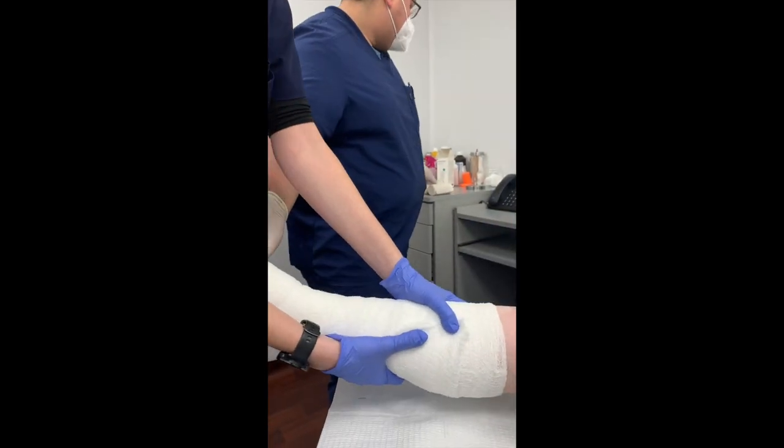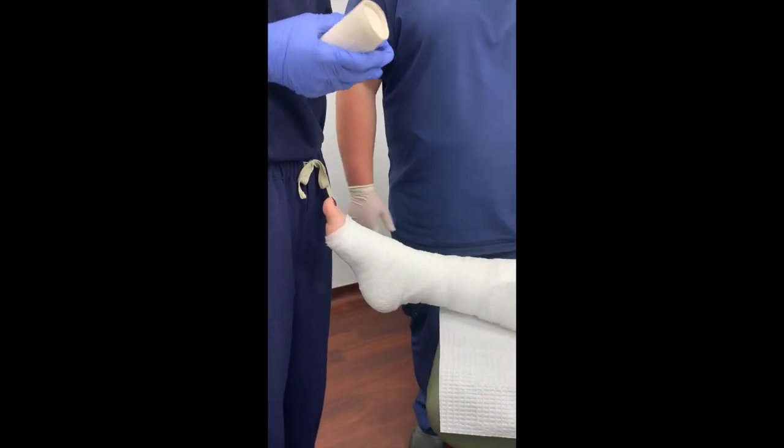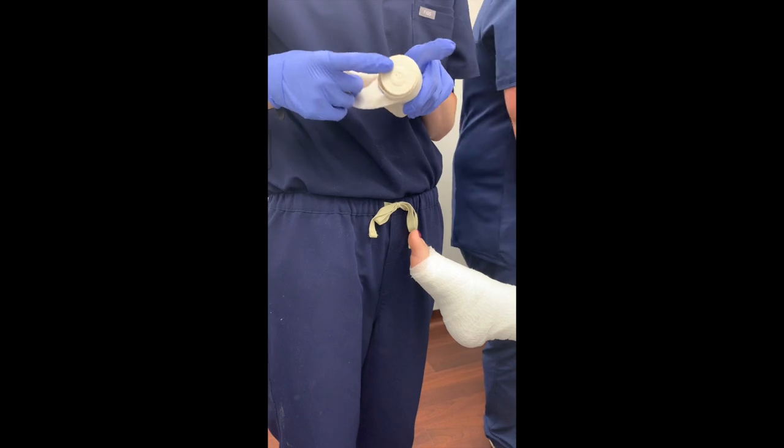Contraindications for this would be if your patient has an acute DVT — obviously you don't want to put on a bunch of compression and dislodge that DVT. So, here again we have the snail with the head of the snail here and the shell up on top.